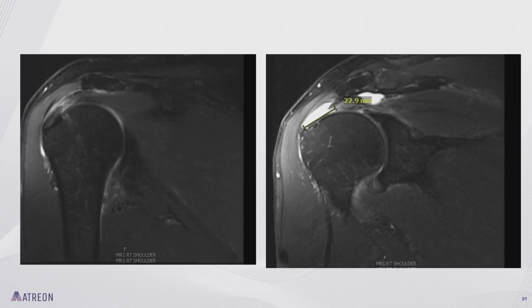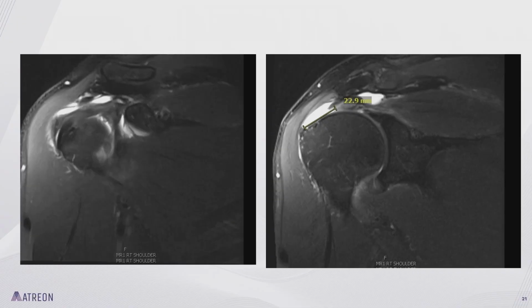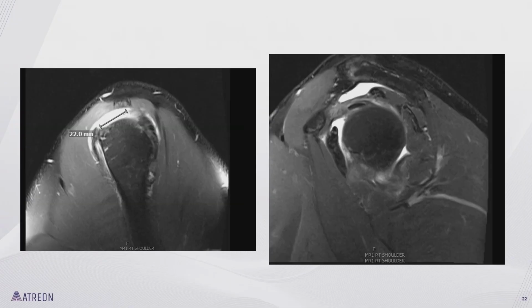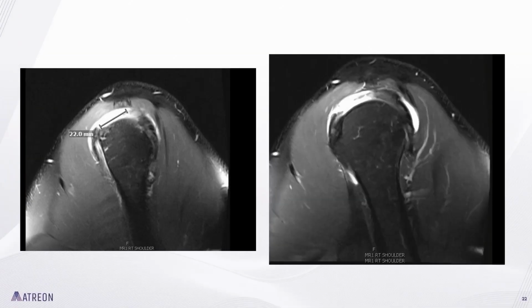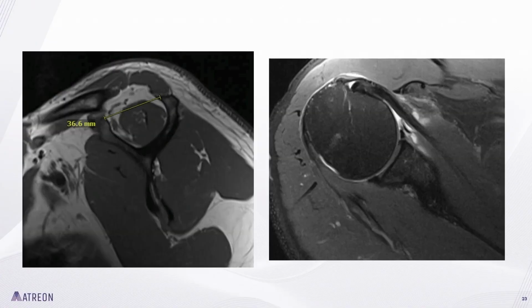And I'll take you through these. So it is somewhat balanced. He probably has infra and subscap, but it's a large tear, and he's not doing well. And these progress, and we know the natural history of rotator cuff tears is to get worse. And then it's large A to P too. So if we put this into our Rohe score, I'll just show it to you again, it's good to look here on the sagittals and see the width. Oh, and then it's probably repairable, right? Because the tangent sign is negative. There's not a lot of atrophy. There's no infra atrophy, but it's a big tear. It's a high risk of re-tear.